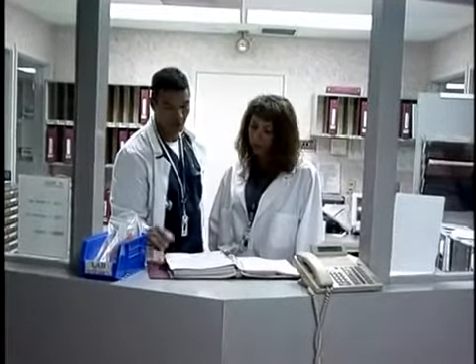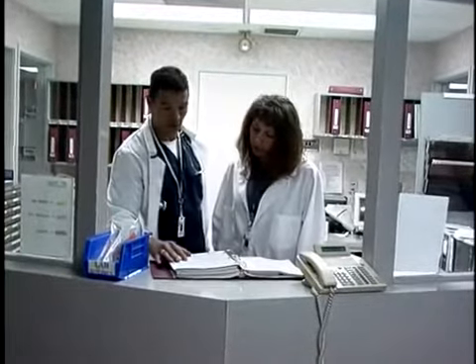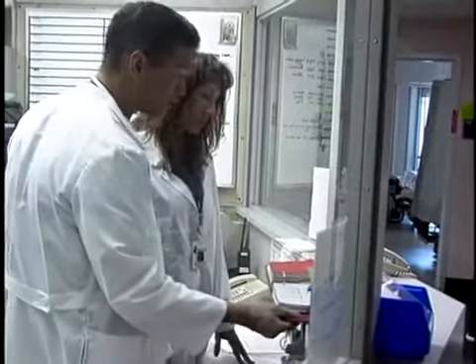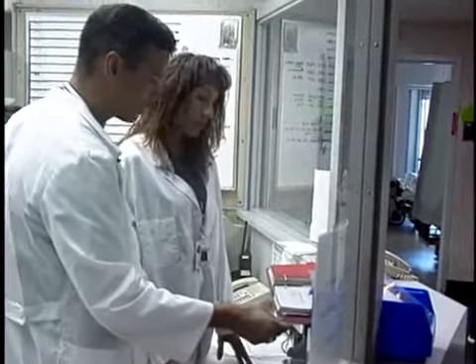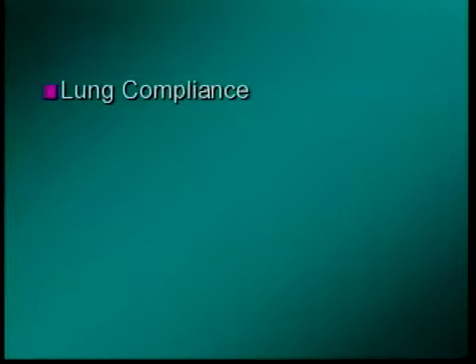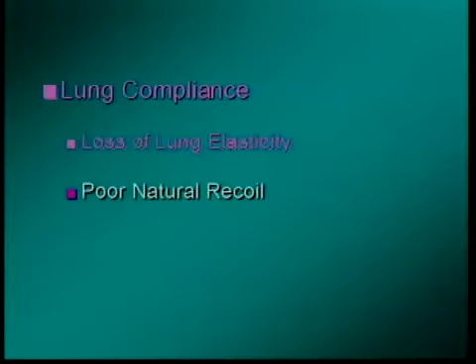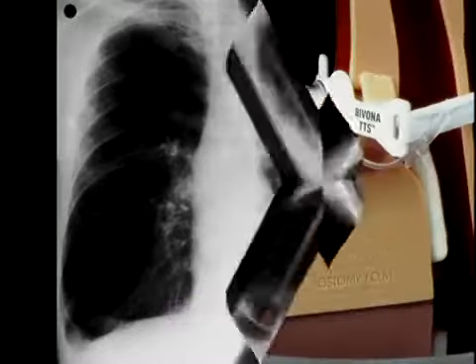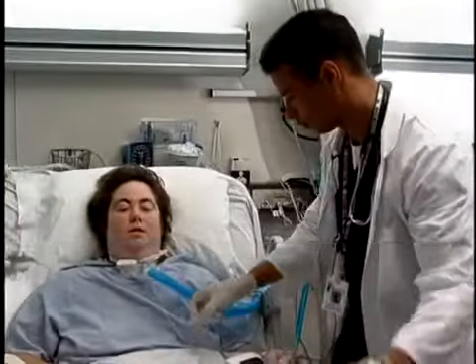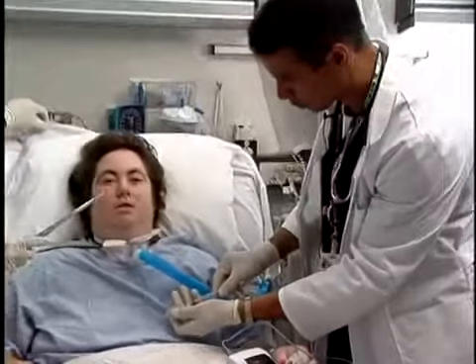The valve may be placed 48 to 72 hours after the tracheotomy is performed if tracheal edema and/or secretions have decreased. Some patients may experience tracheal edema following a trach tube change. These patients should be assessed carefully to ensure airway patency. Careful assessment for valve use is needed to avoid potential complications associated with air trapping that can occur with non-elastic lungs, such as with severe COPD. An appropriately sized tracheostomy tube is crucial when considering valve use. It is necessary to evaluate airway patency prior to valve placement.